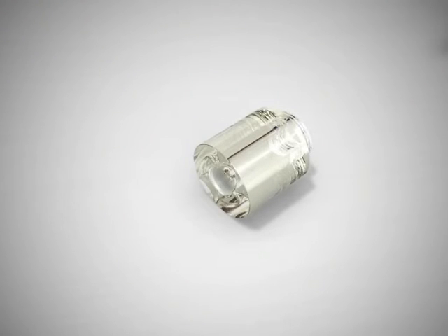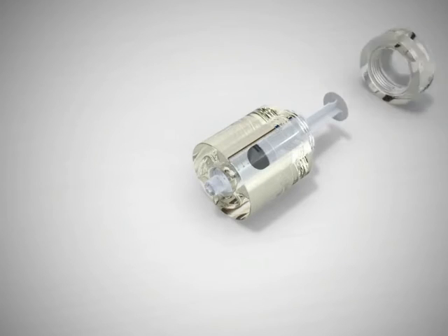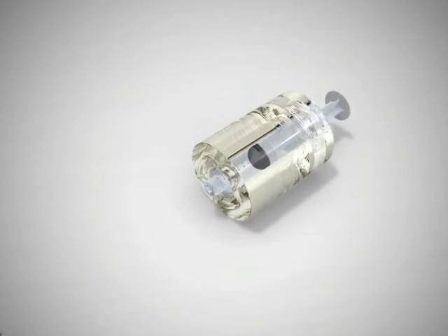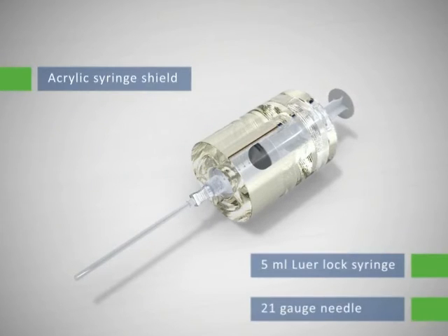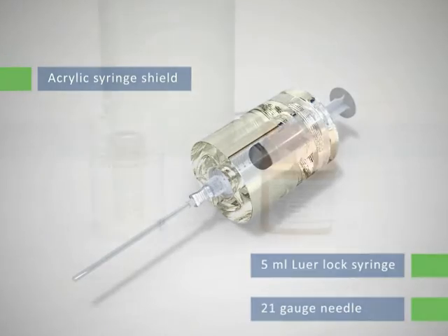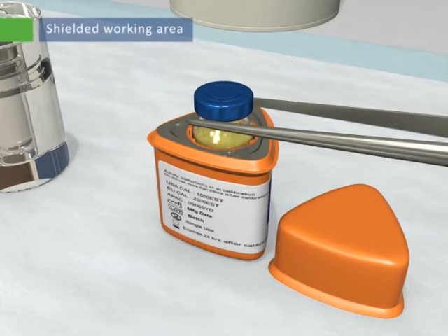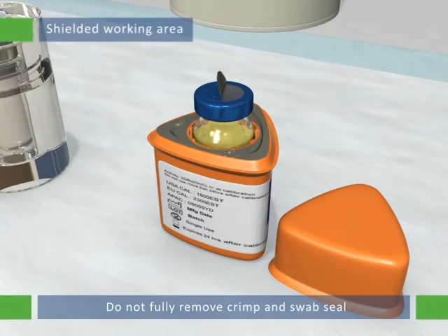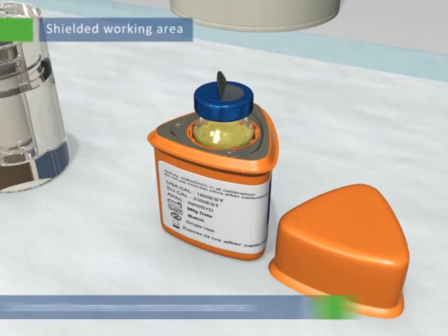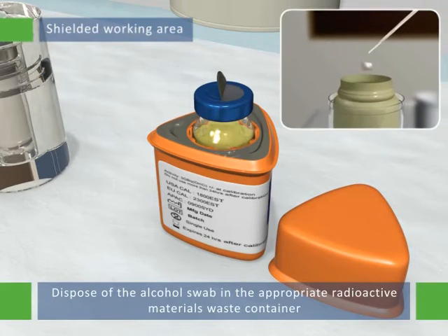Place a 5-milliliter luer lock syringe into the provided acrylic syringe shield. Screw the lid on to secure the syringe. Attach a lubricated 21-gauge needle, at least 50 mm in length, to the syringe. Leave the needle cap attached to the needle. Partially remove the center of the aluminum crimp seal from the SIRSpheres microspheres shipping vial with alcohol-disinfected forceps to expose the septum. Do not fully remove the crimp and swab seal. Swab the septum with an alcohol wipe held in forceps. Dispose of the alcohol swab in the appropriate radioactive materials waste container.